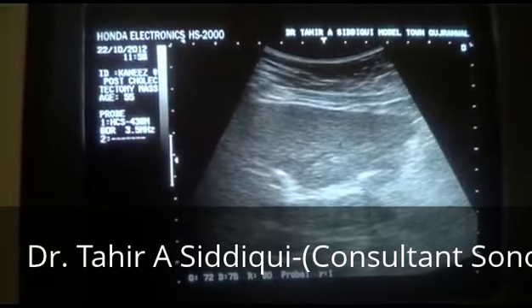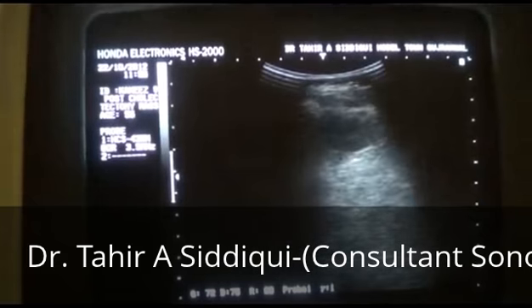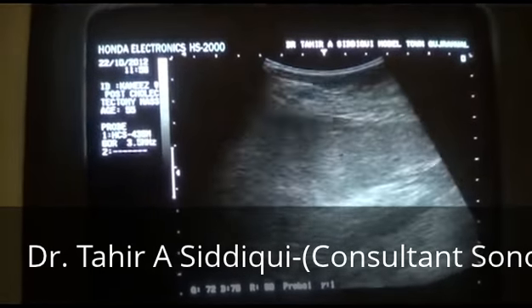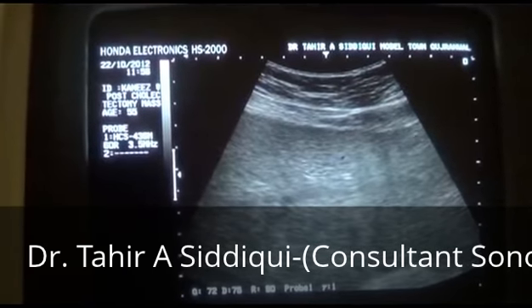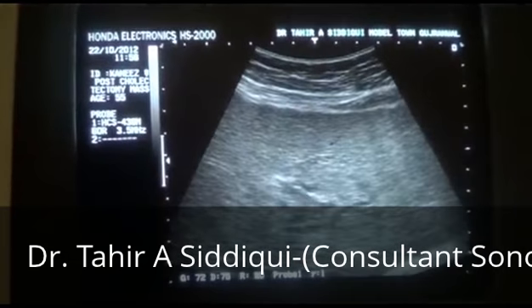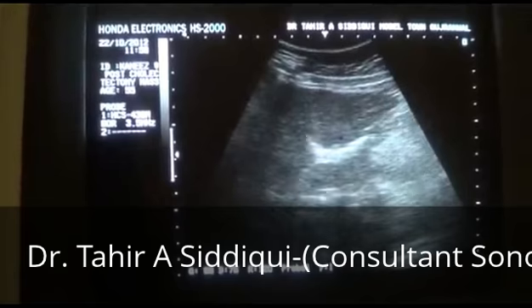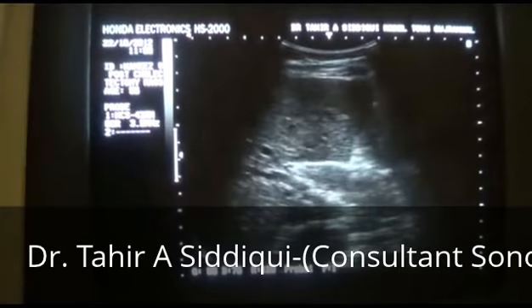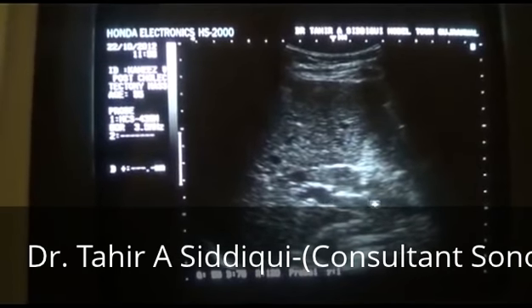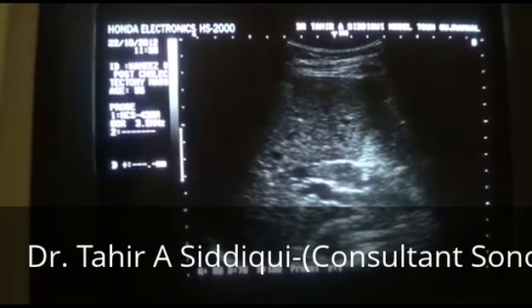A second finding in this patient that has to be evaluated is that I did see some dilation of the intrahepatic bile ducts. Here you see. She gives history of fever with rigors, and here you see that this is the portal vein. This is the hepatic artery, transverse section.